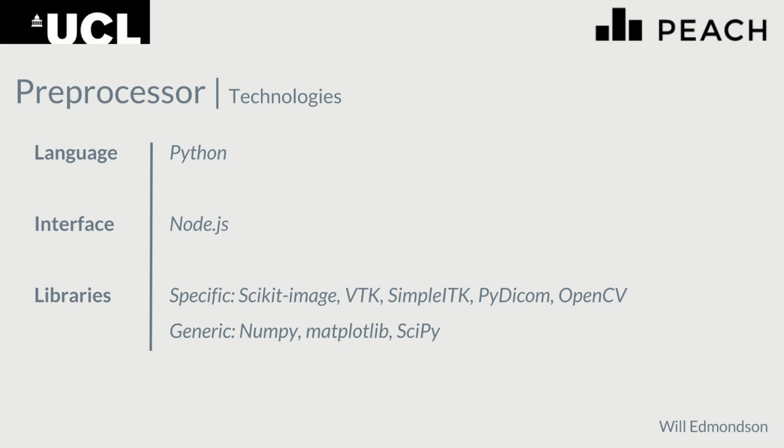A few of the technologies that were used in the implementation. So the main language here is Python for the data analysis, interfacing it with a web application is Node.js, which is a natural pairing. And then the libraries that we used: Scikit-Image, VTK, Simple ITK, PyDICOM, and OpenCV on the image processing side, and then on more generic libraries, NumPy, Matplotlib, and SciPy.